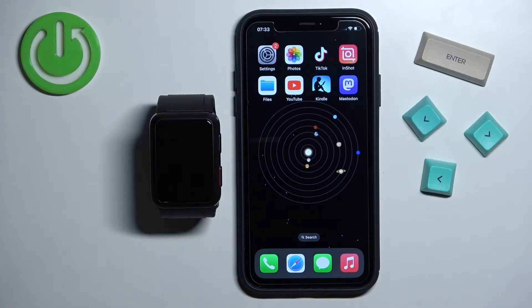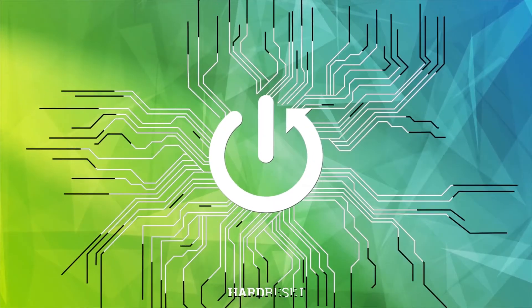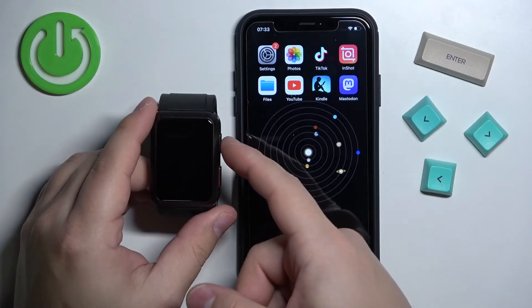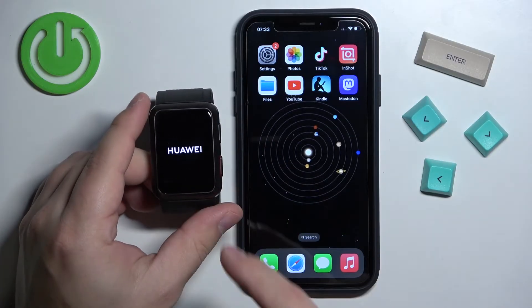Welcome! In front of me I have the Huawei Watch D and I'm going to show you how to pair this watch with an iPhone. First thing you will need to do is turn on the watch. Simply press and hold the home button right here and keep holding it until you see the Huawei logo on the screen.